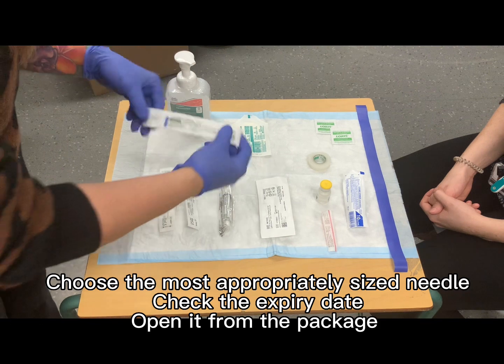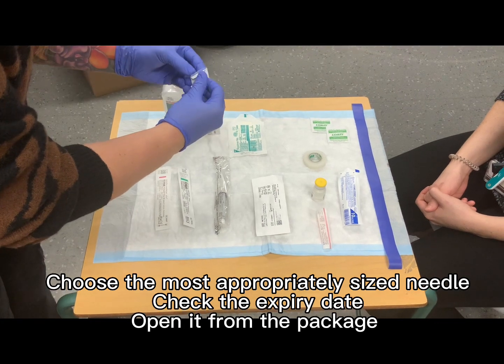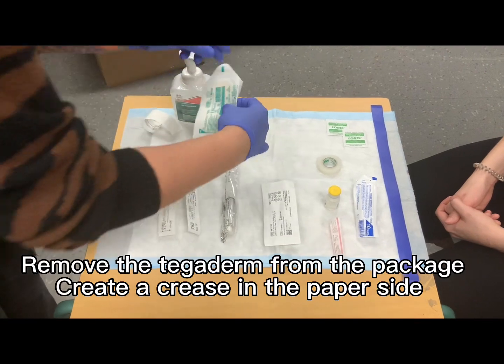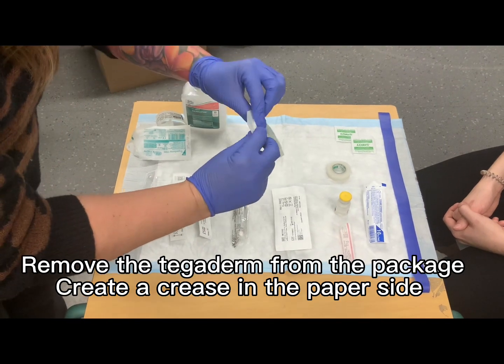Choose the needle size that is most appropriate to the situation. Check the expiry date and then open it from the package. Keep the needle in the package until you're ready to use it. Take the tegaderm out of the package and create a crease in the paper side. This makes it easy for you to remove the paper from the sticker when the time comes.